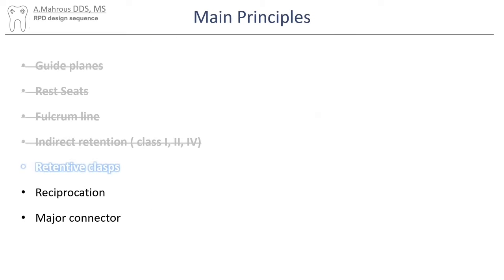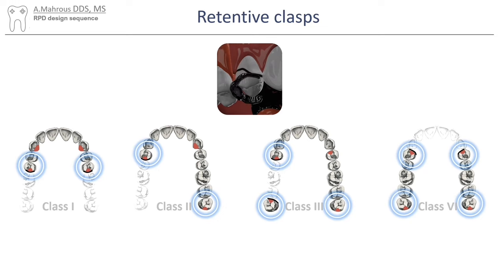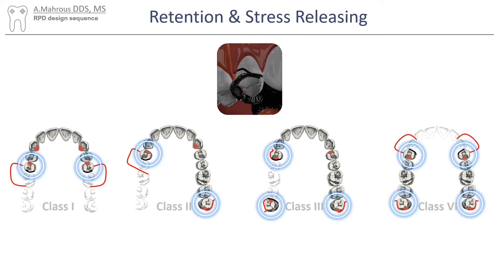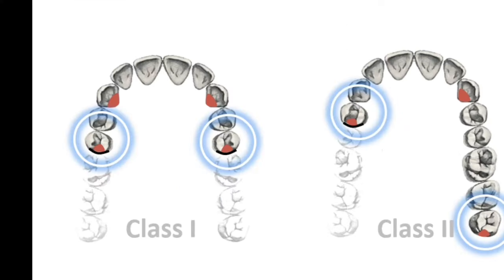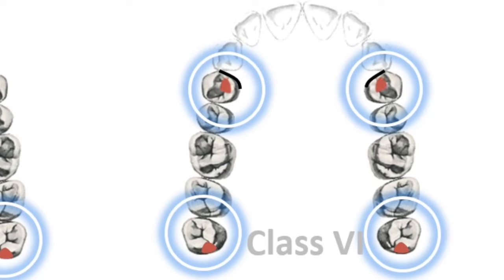Let's move on to the next step: retentive clasps. Retentive clasps are placed on teeth adjacent to the edentulous spaces. Additionally, each arch should have two to four clasps for adequate retention. Due to the need for stress breaking, the position of the rest seats on class 1, class 2, and class 4 cases will need to be changed for the use of an I-bar clasp. For more information on stress breaking, please refer to the video linked here.